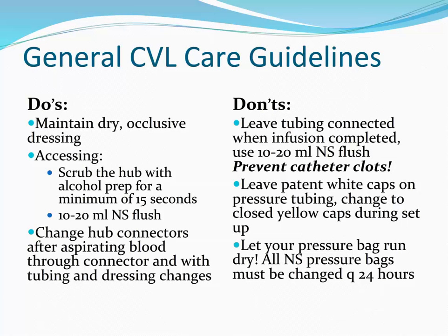Do not let your pressure bags run dry. All normal saline pressure bags should be changed every 24 hours. No IV bag, flush pack, or medication should be hanging at the bedside for greater than 24 hours. Please check these during your SBAR.